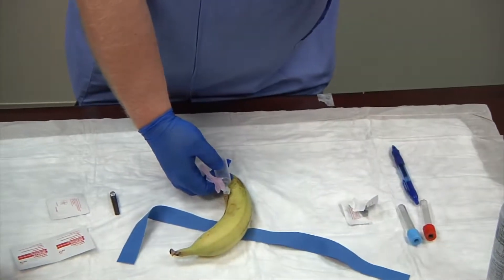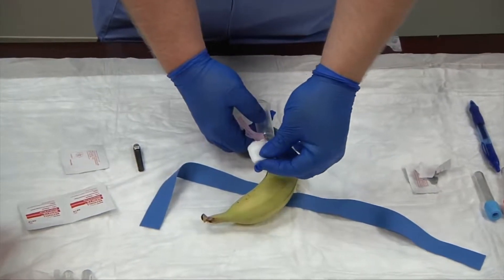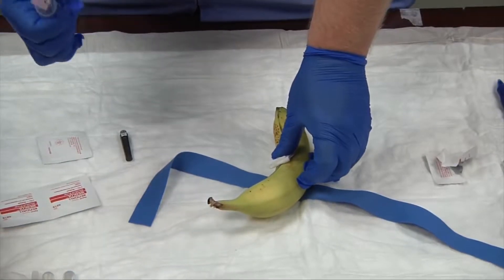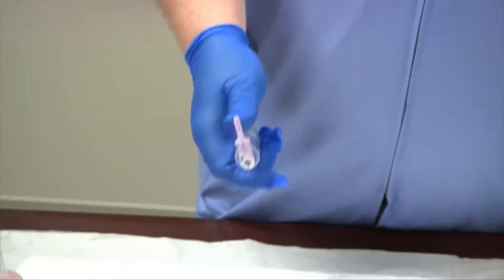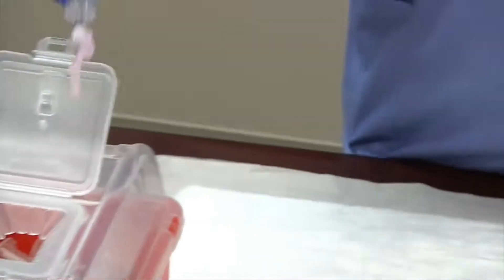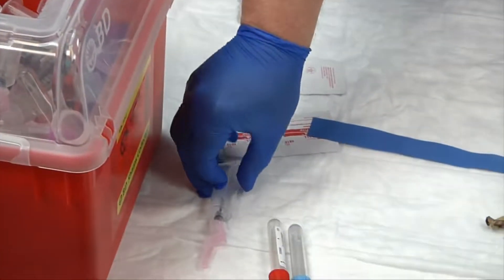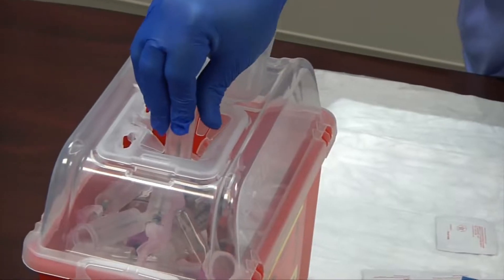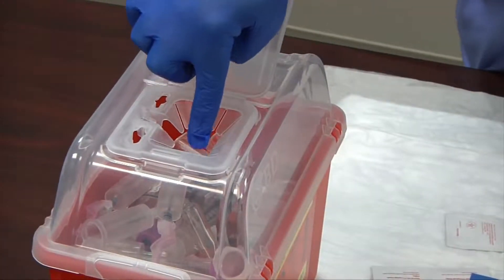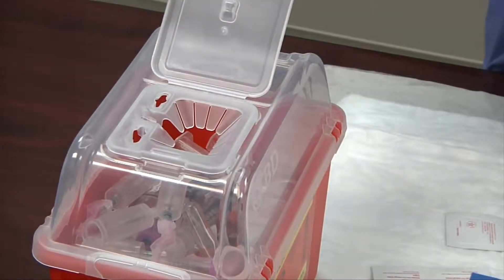We want to pinch our gauze and fold it over again in four corners to make a pressure bandage. I'm going to pull out my needle and immediately cover with gauze and safety-cap the needle all in the same motion. As you pull your needle out, immediately safety-cap it and go directly into the biohazard box — never lay it down on the table. Drop the needle in freely, being careful not to stick your finger into the container. We never pull needles or any trash back out of the biohazard box.